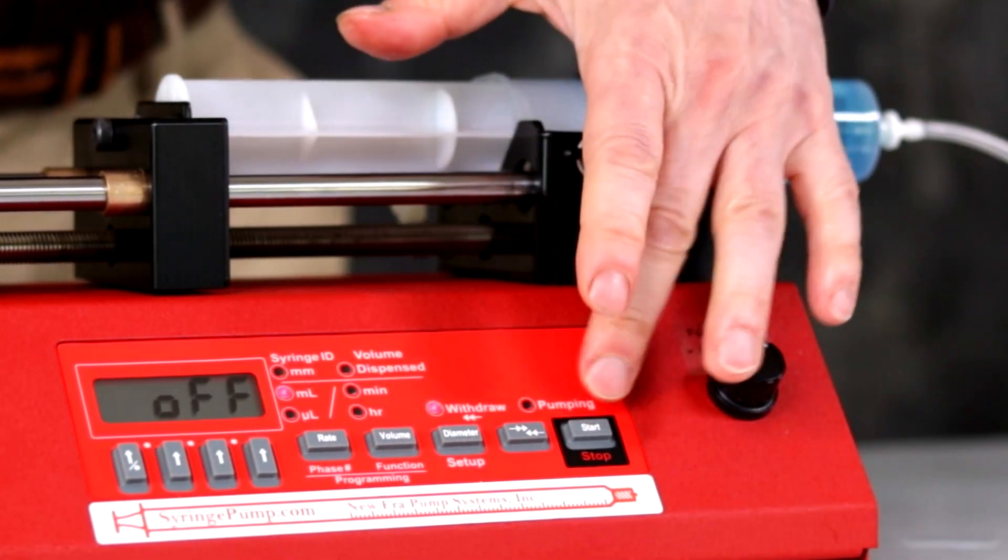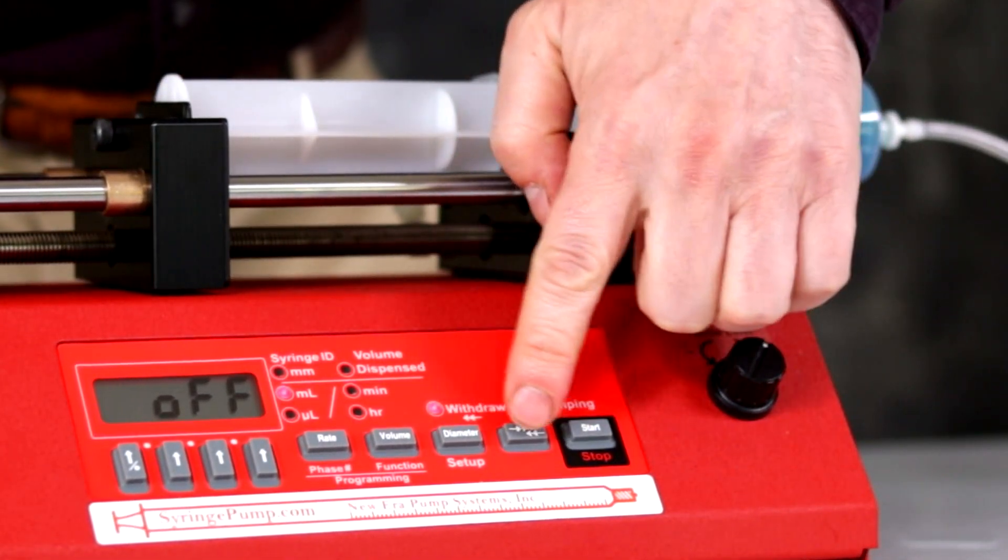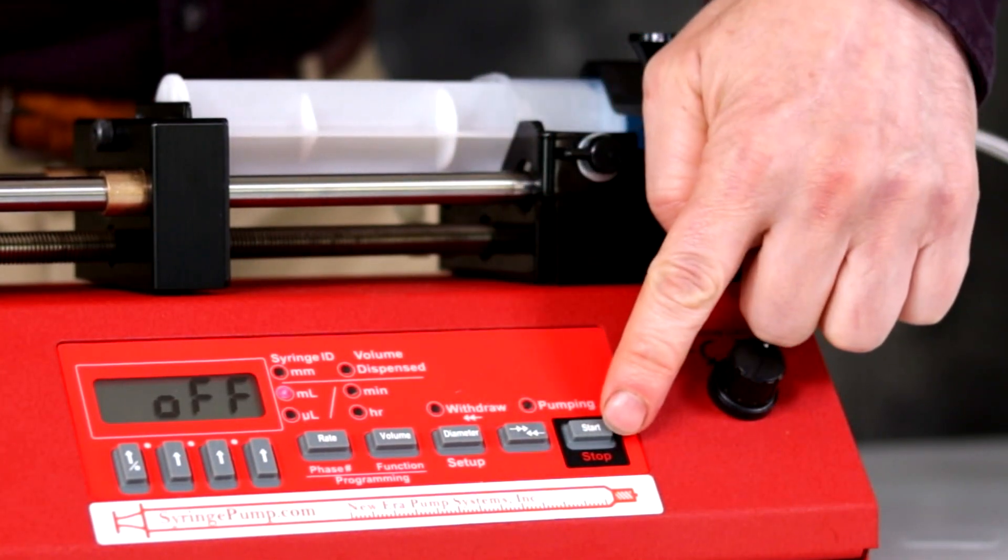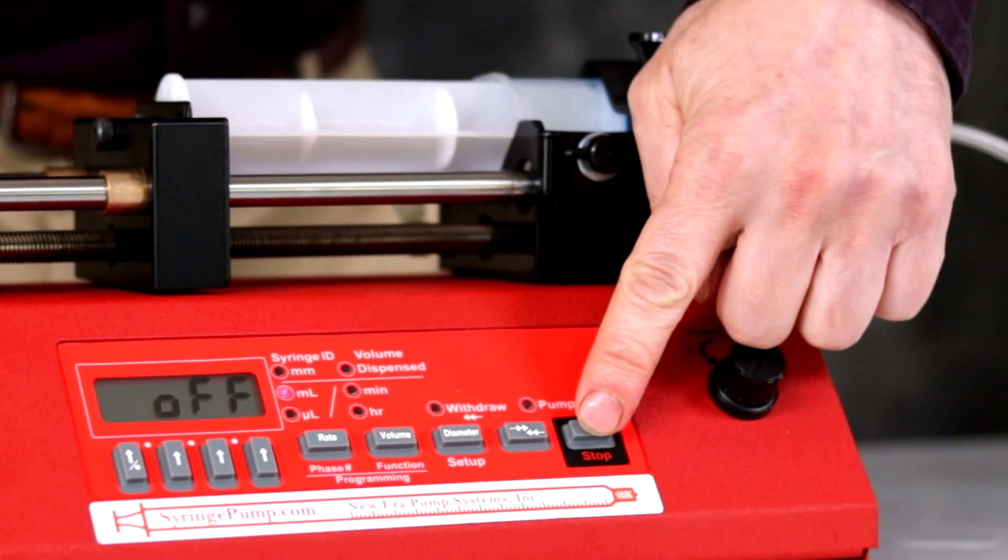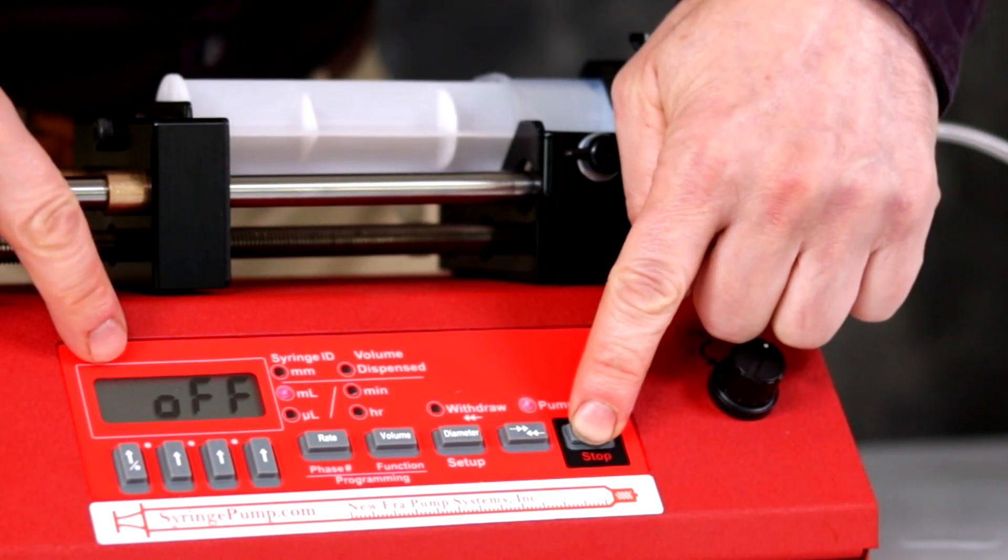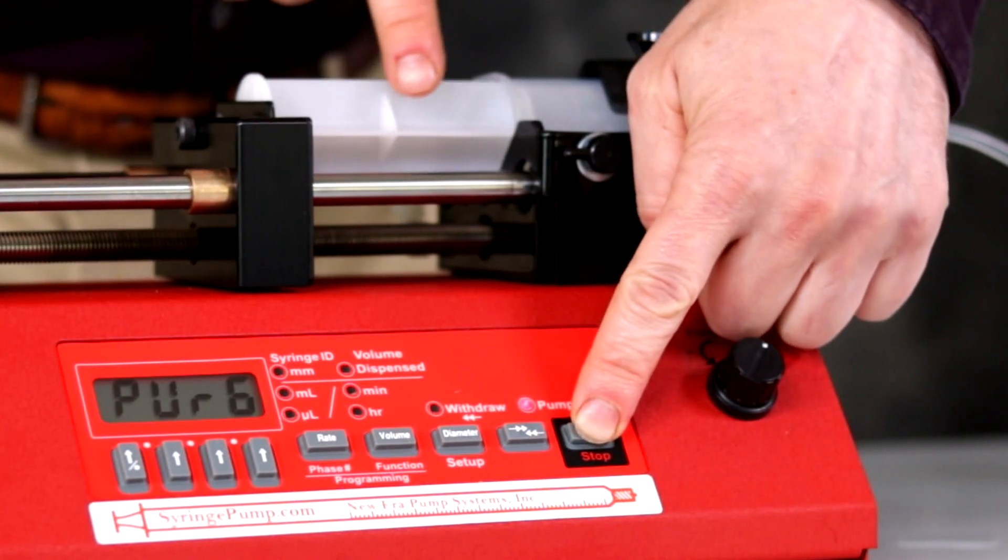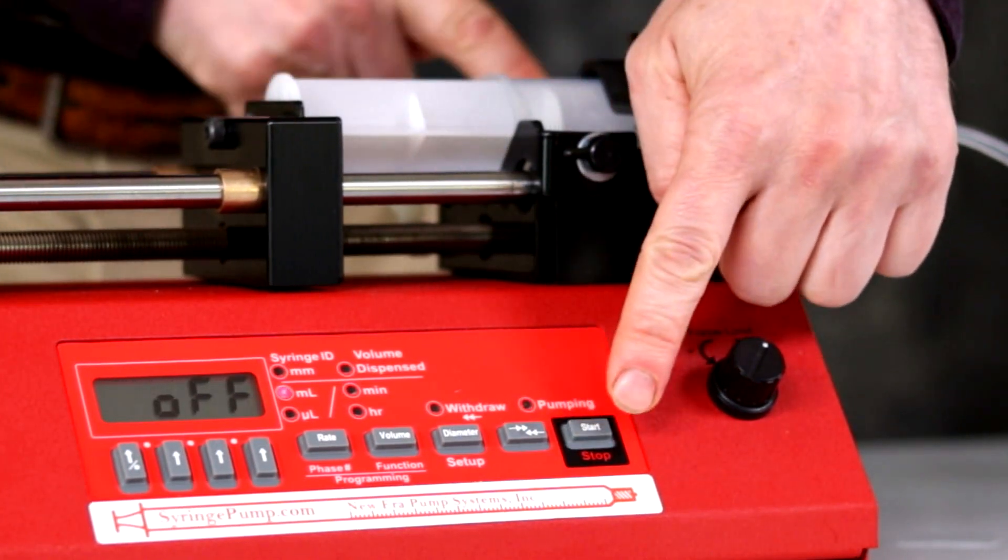Begin by purging the syringe. Make sure your direction is set for infusion. Press and hold the start key until you see PURG in the display. The pusher block will move. Once filled, remove your finger from the pump.